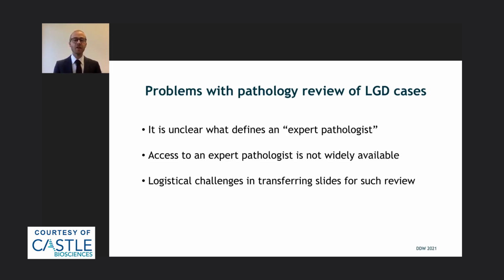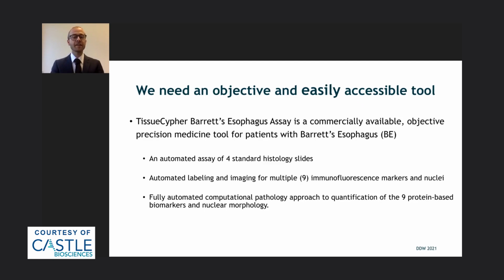First, it is unclear what defines an expert pathologist. Second, access to expert pathologists is not widely available. And third, there are still logistical challenges in transferring slides for such review. So we all agree that there's a compelling need for an objective and easily accessible tool.